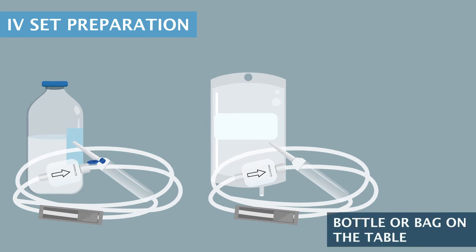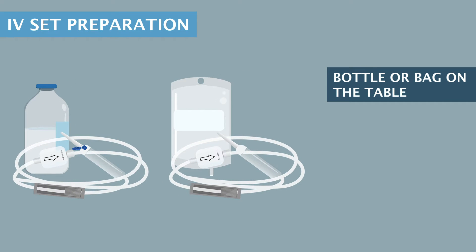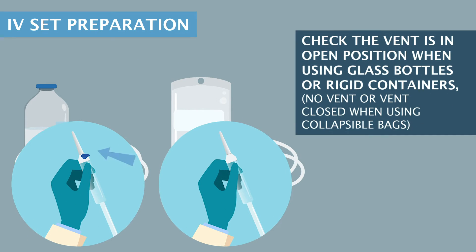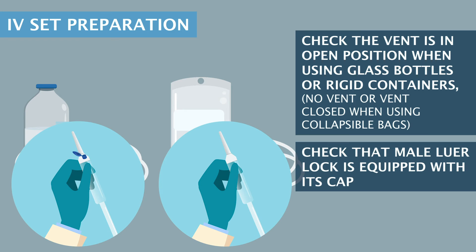IV Set Preparation. Place the bottle or bag on the table. Set the roller clamp in closed position. Check the vent is in open position when using glass bottles or rigid containers. No vent, or vent closed, when using collapsible bags. Check that the male luer lock is equipped with its cap.